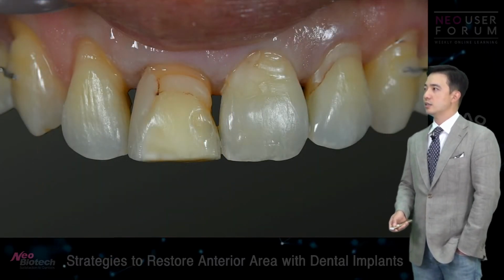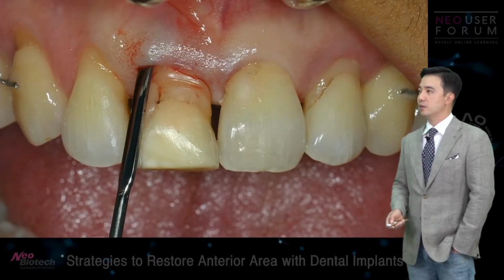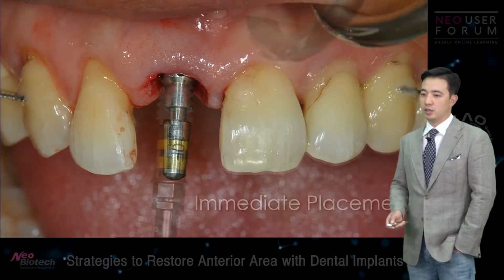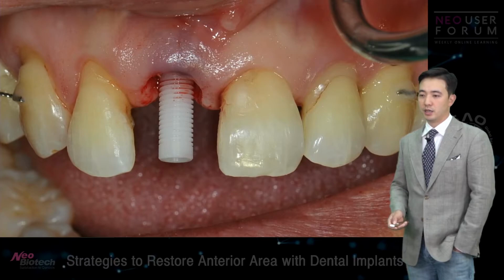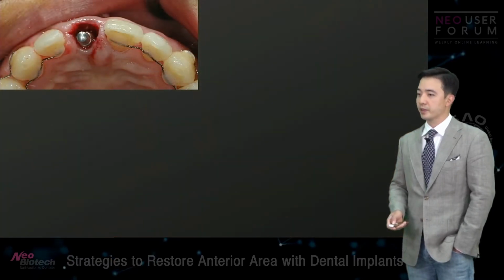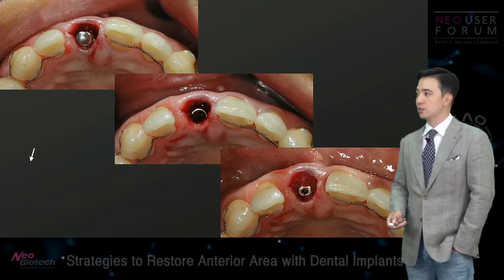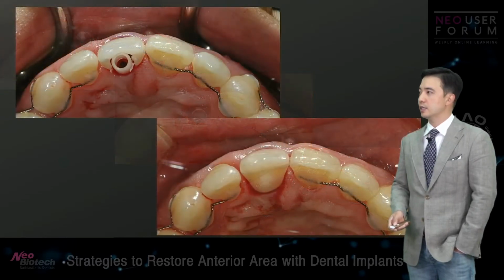So this is on the day of implant placement, extracted in a minimally invasive fashion using a periotome, immediate implant placement. Also, for this case, we did immediate provisional restorations because we had such good initial stability. So I added a little bone right there.